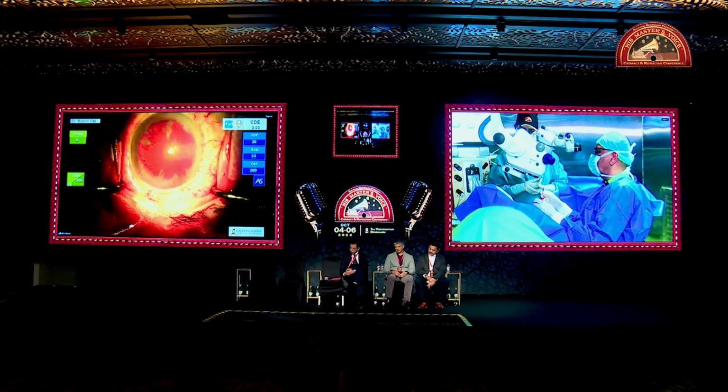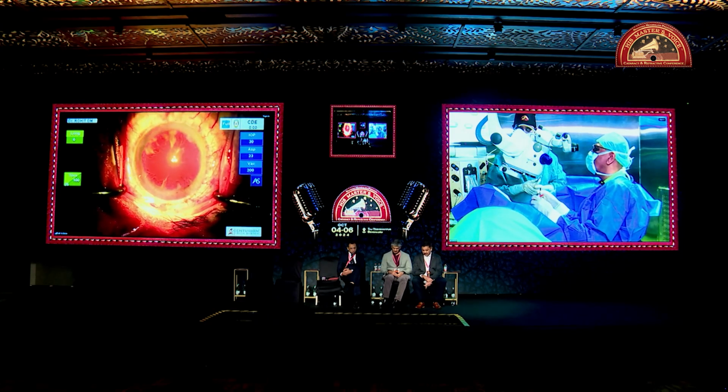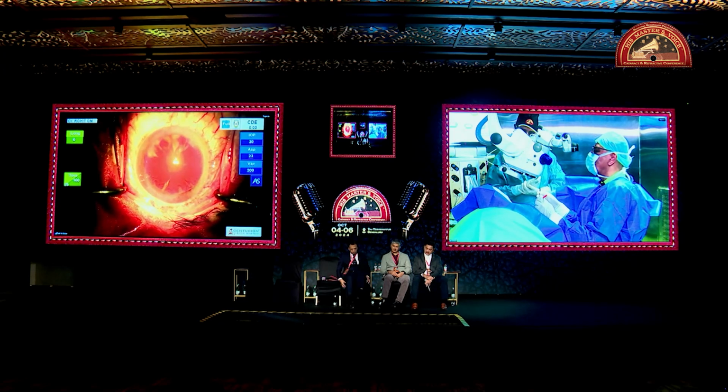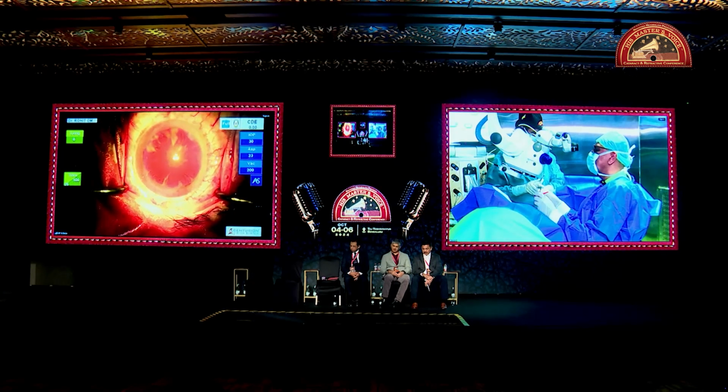So I've been asked to showcase a patient who is a high myope, and the IOL power is turning around to minus 0.46. So we would be implanting a zero diopter intraocular lens, because we want that with this sensor from Johnson & Johnson, because that would help reduce the incidence of posterior capsular opacification. And if by any means we have to do any posterior YAG laser capsulotomy, that will prevent herniation of vitreous into the anterior chamber and cause sequels.